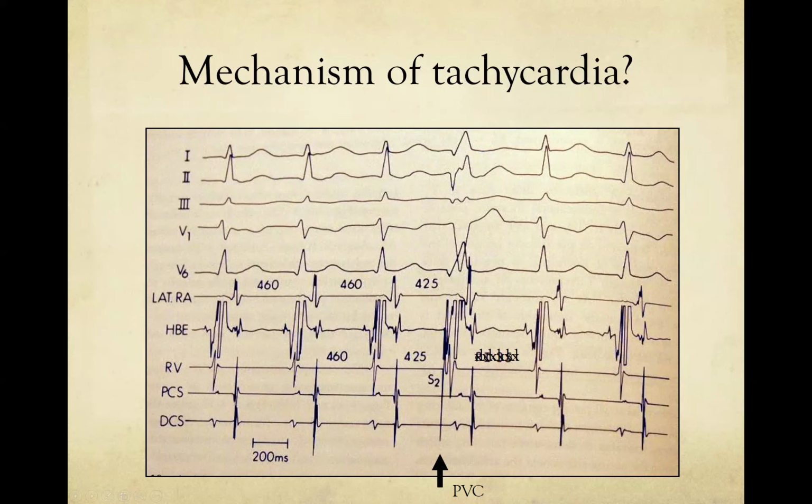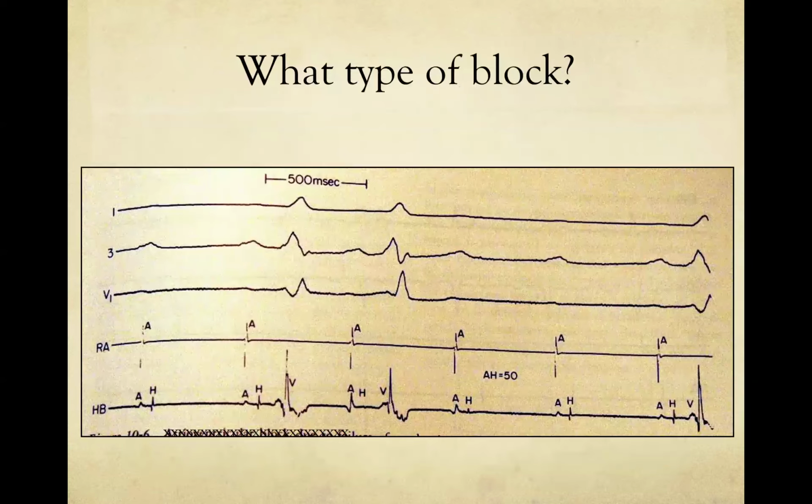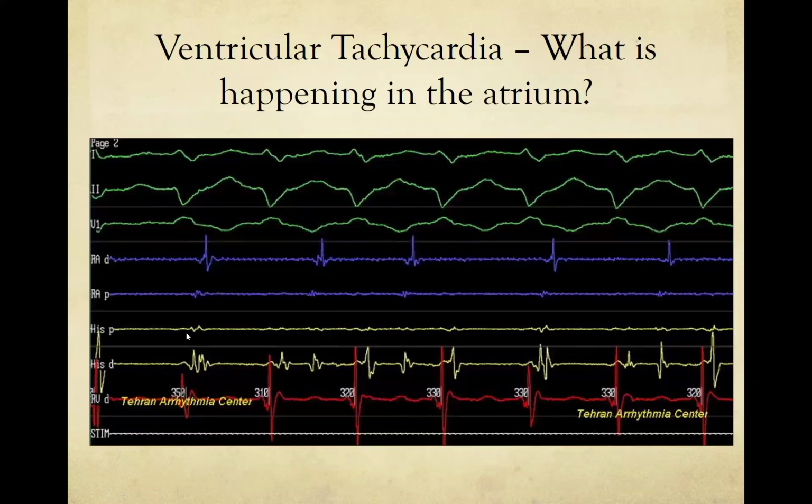That's very different than what we just saw with our VA Wenckebach. The point is, we wouldn't normally have an RA catheter in the lateral right atrium. In other words, it usually just sits in the atrial appendage. So you always want to look at the information that they're giving you. The other thing I would say is that the way that Barry and I display our images during an EP case is very standard. So if you're seeing something very different here, ask yourself the question, why are they showing it differently? And that's exactly what you did, Ivana.